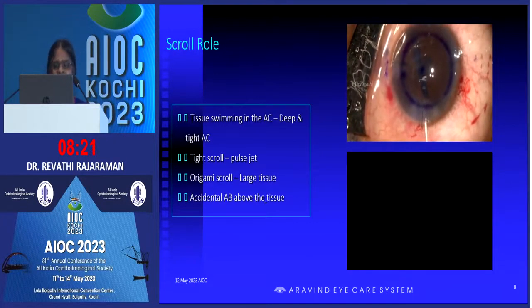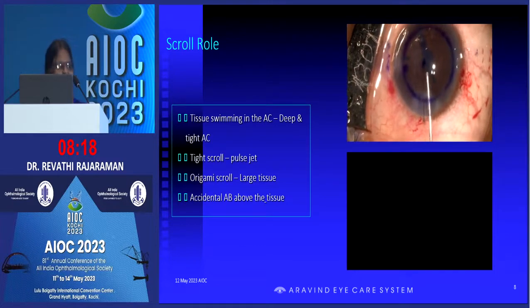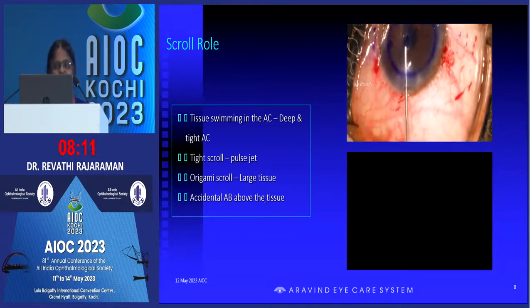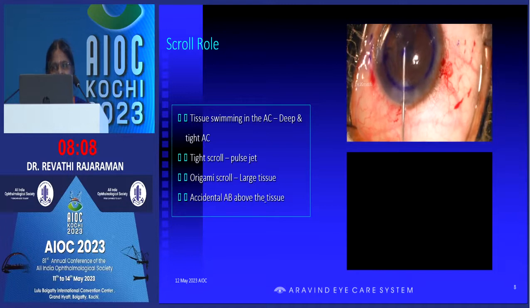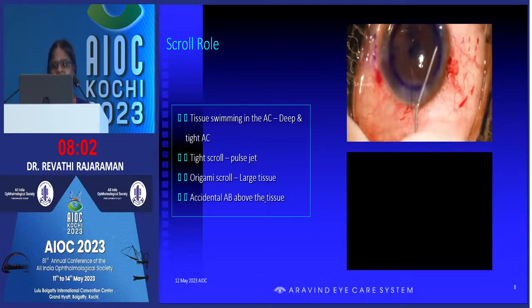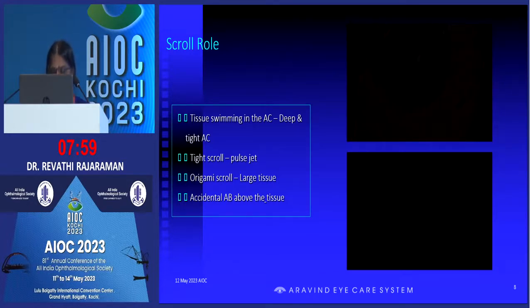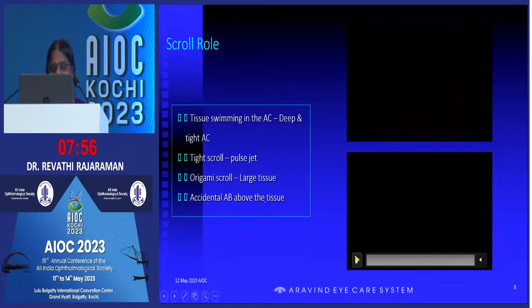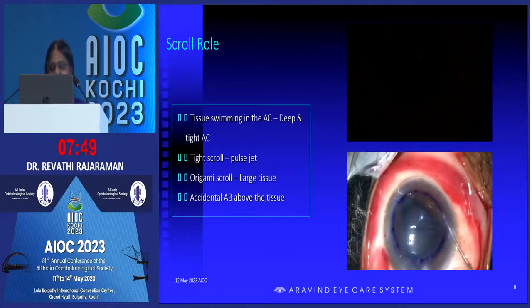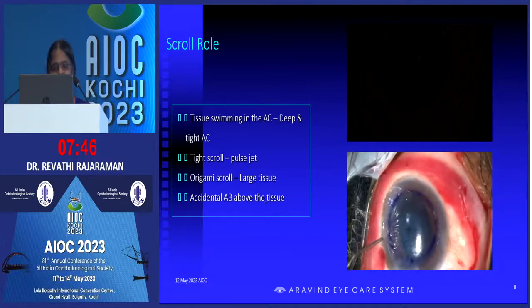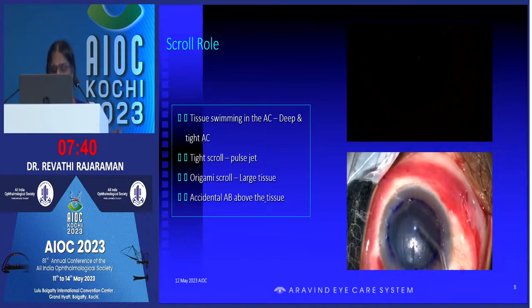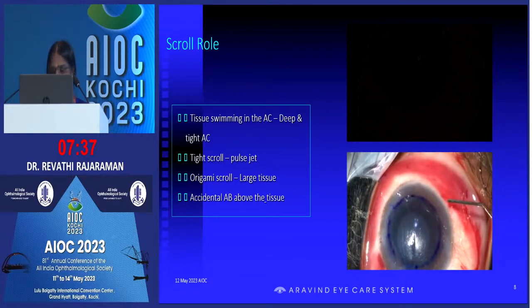Scroll management was already mentioned by Dr. Fogla. For a tight scroll, we can use Fogla's cannula — if we are confident about the orientation — and go in with a jet of fluid to unscroll and complete the procedure. For a large graft, initially we tend to make very large grafts thinking we are replacing a large amount of endothelium, but they can get folded like origami and become difficult to manage. Instead, as Dr. Basak shows, going for a peripheral punch will give more endothelial cells.